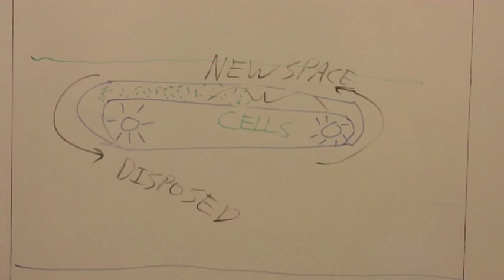The difficulty with this design is that the cells still require new food, so the researcher still has to come back to replace the media on a regular basis. Additionally, it's more mechanically complicated than I would like, especially given that the device has to be submerged at all times in media.